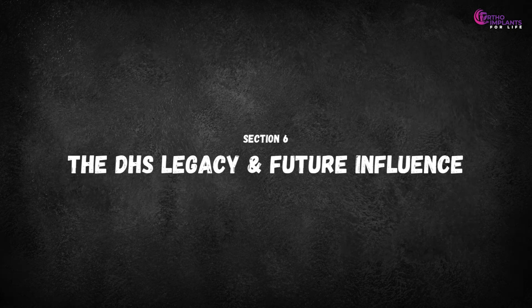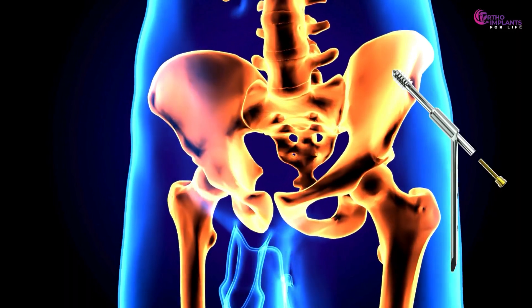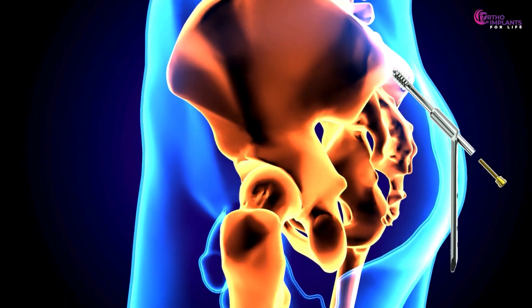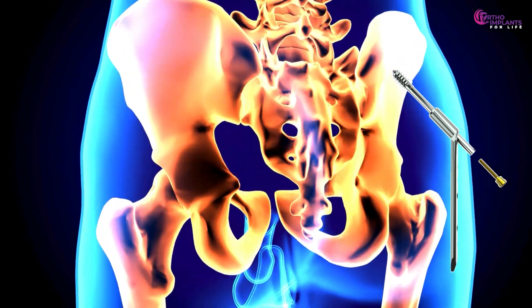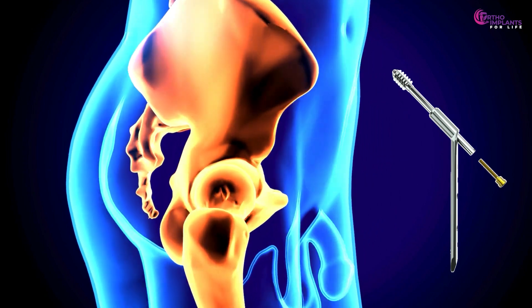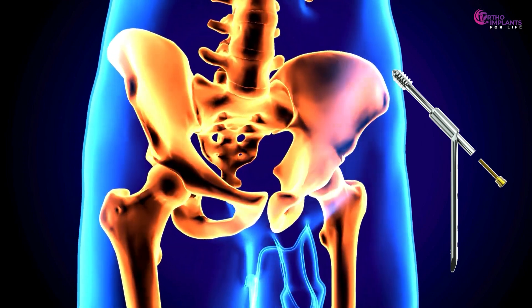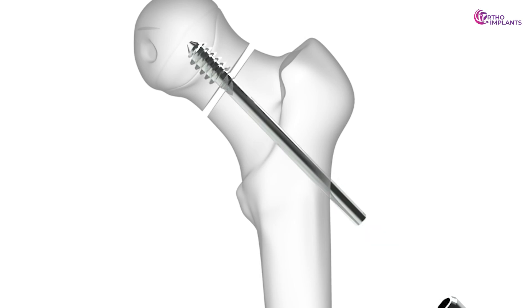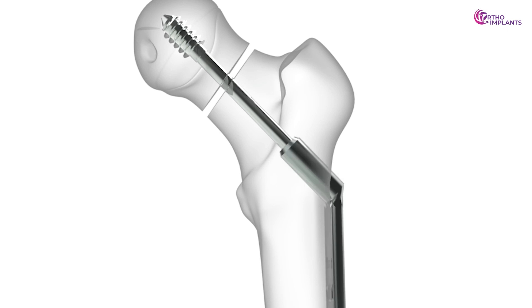The DHS legacy and future influence: the DHS hinge concept isn't just history — it informs today's implant innovation. From sliding hip screws to smart compression implants and load-sharing designs, biomechanics continues evolving. The DHS remains foundational in emerging markets and low-resource settings due to its effective simplicity and years of clinical data. An implant isn't just a screw; it's a biomechanical partner in healing.